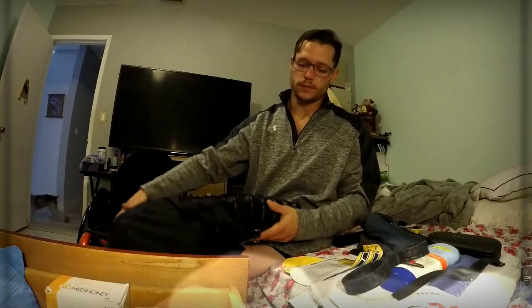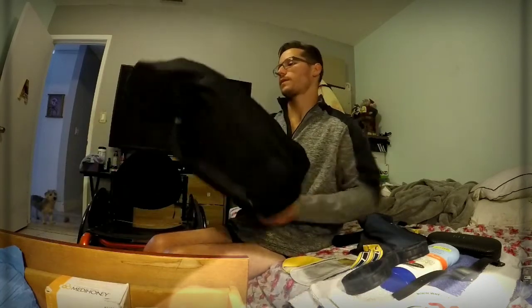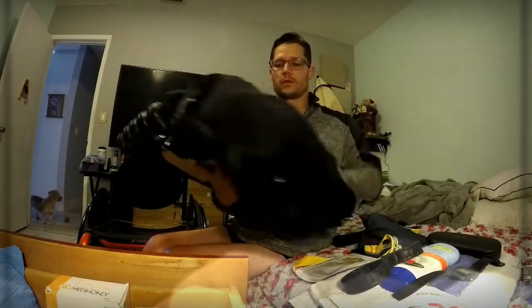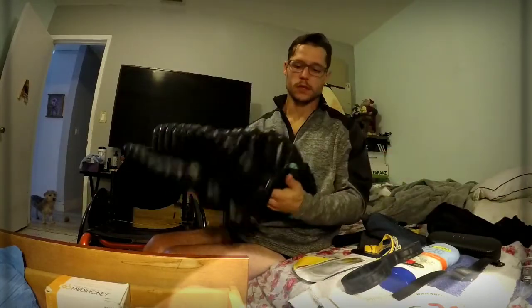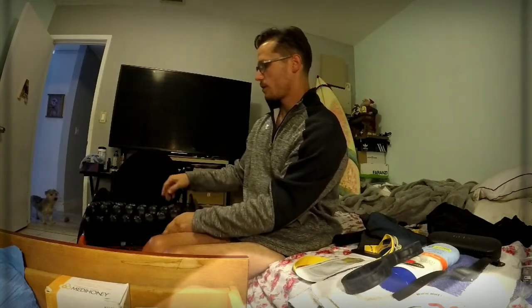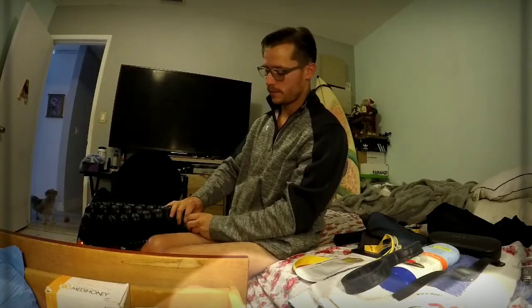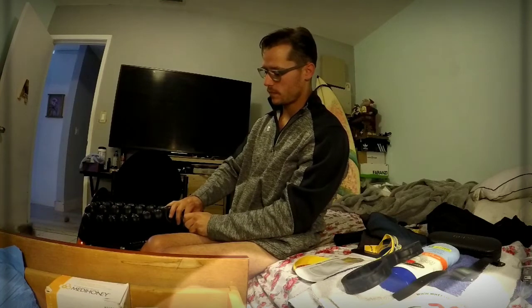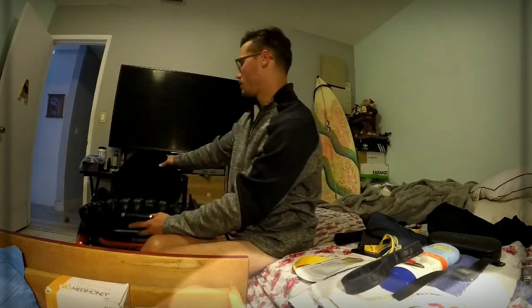And I do it at an angle like that, so it can properly seal. You know what, I might as well just take off the cushion. Alright, so then I put it down, make sure everything's still crimped. Everything's crimped, and then I open the valve. Still, air is coming out a little bit. I open it up like that. Just the back a little bit.